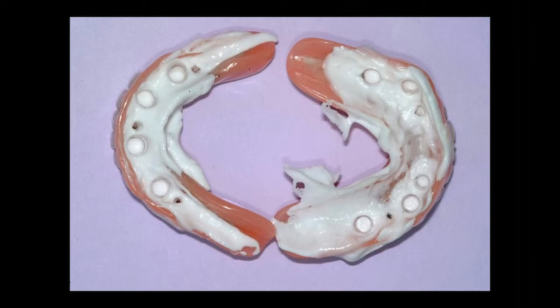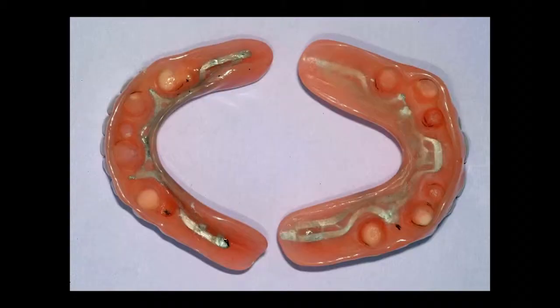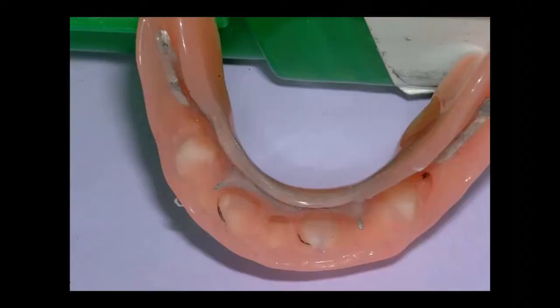So here we had our final bridges. We're checking with the fit check to make sure she's not showing through anywhere. We relieve all these things adequately. You can see the metal frameworks that are incorporated into the overdentures. See right here where we mark with the pencil? That's where the fit check was showing through. Like over here. And there's where it's showing through. So we're going to relieve that again.